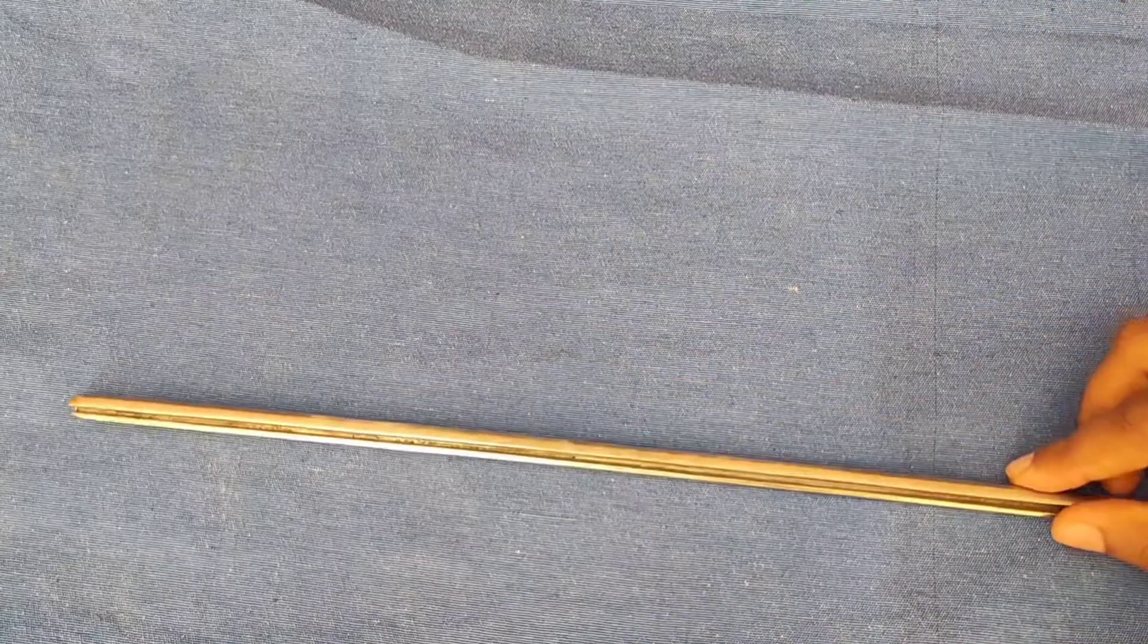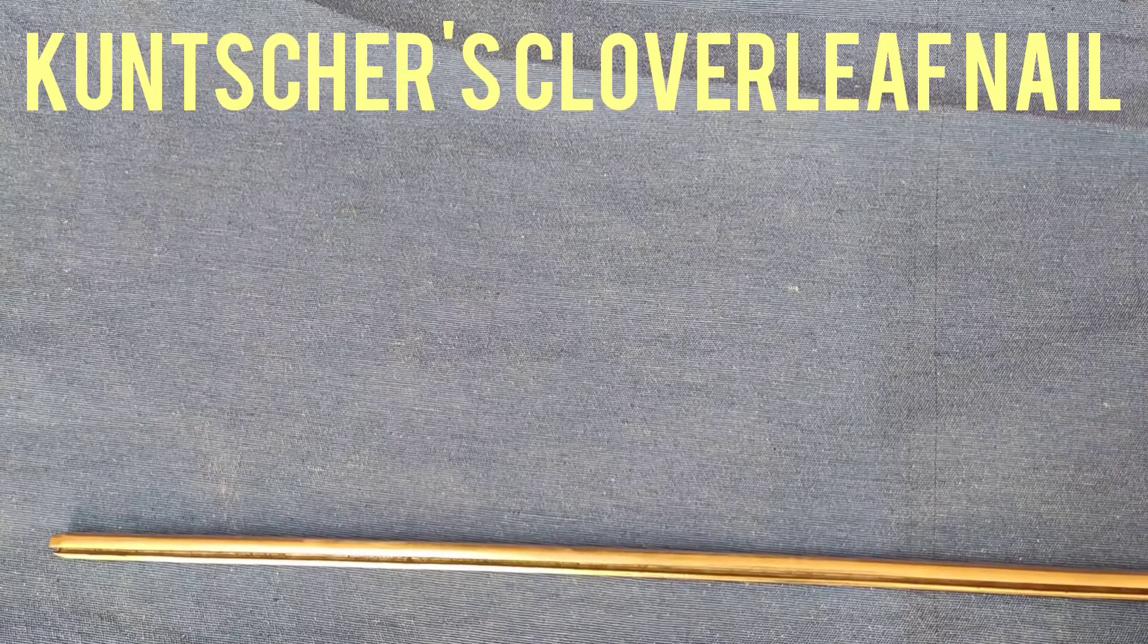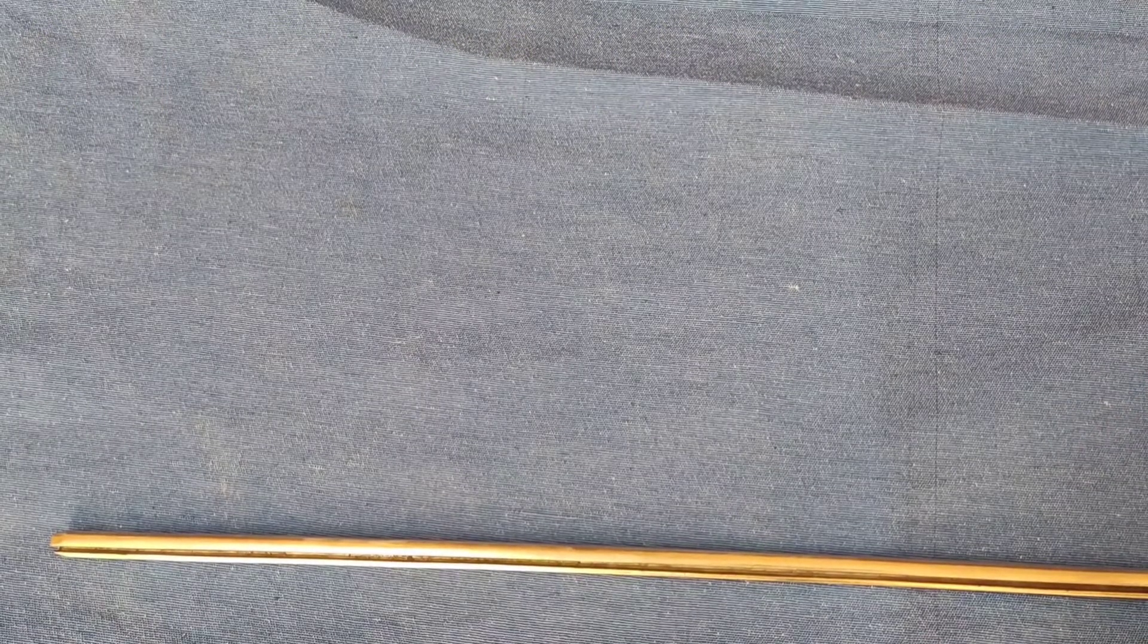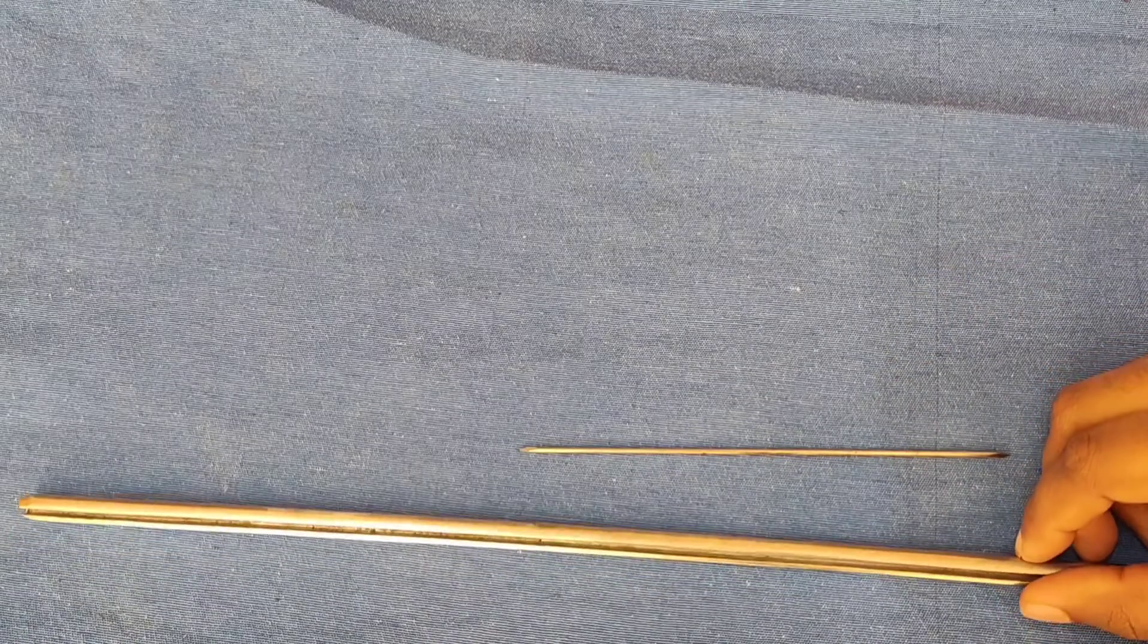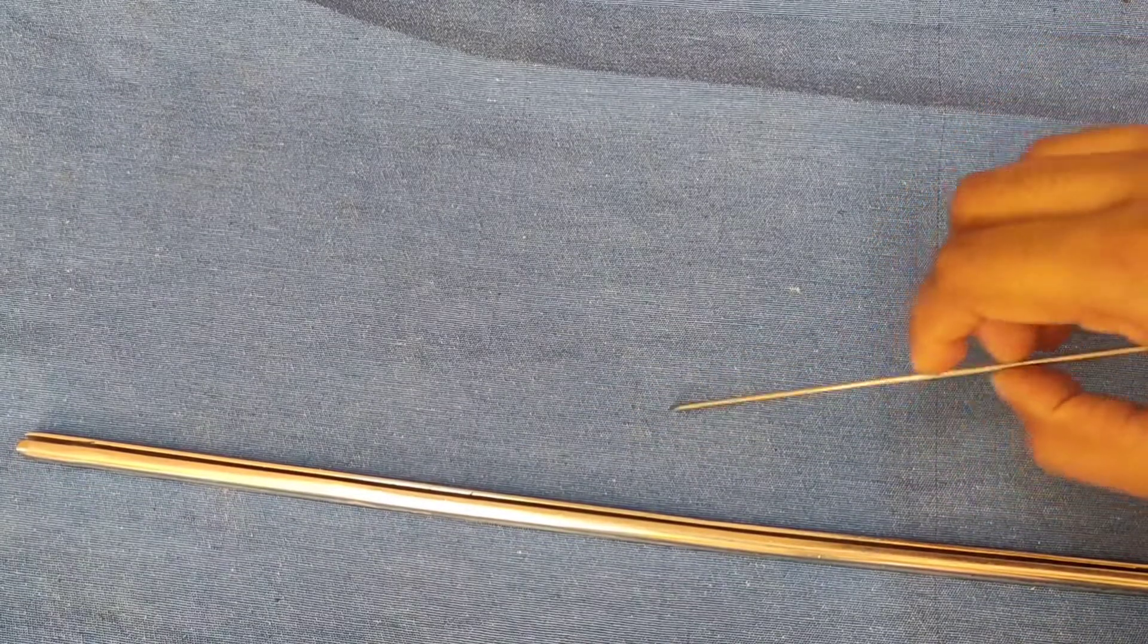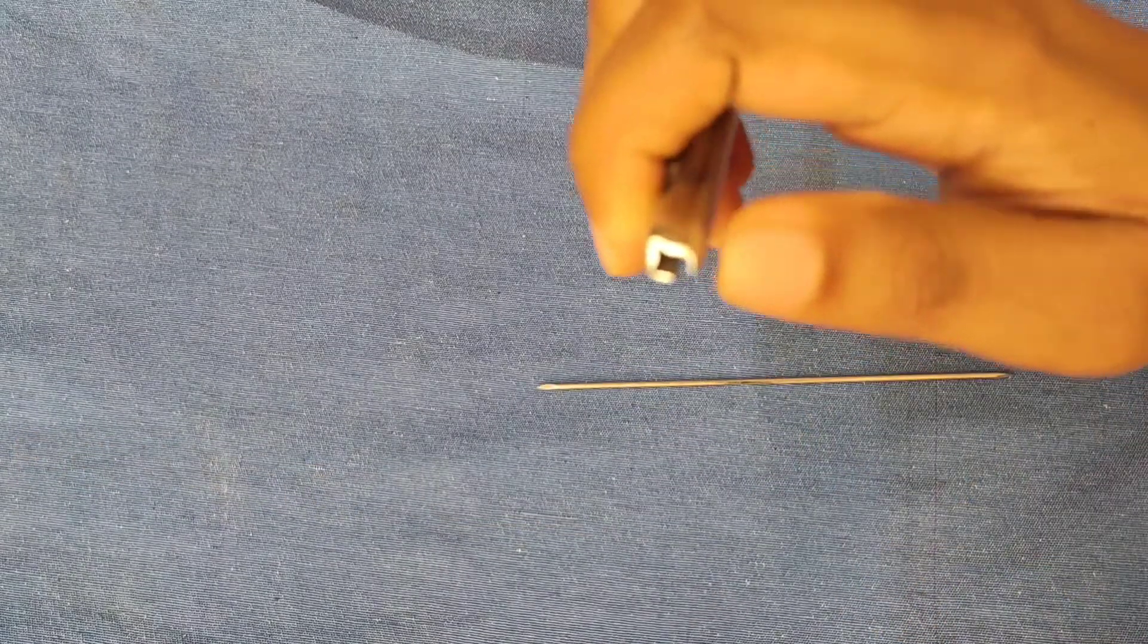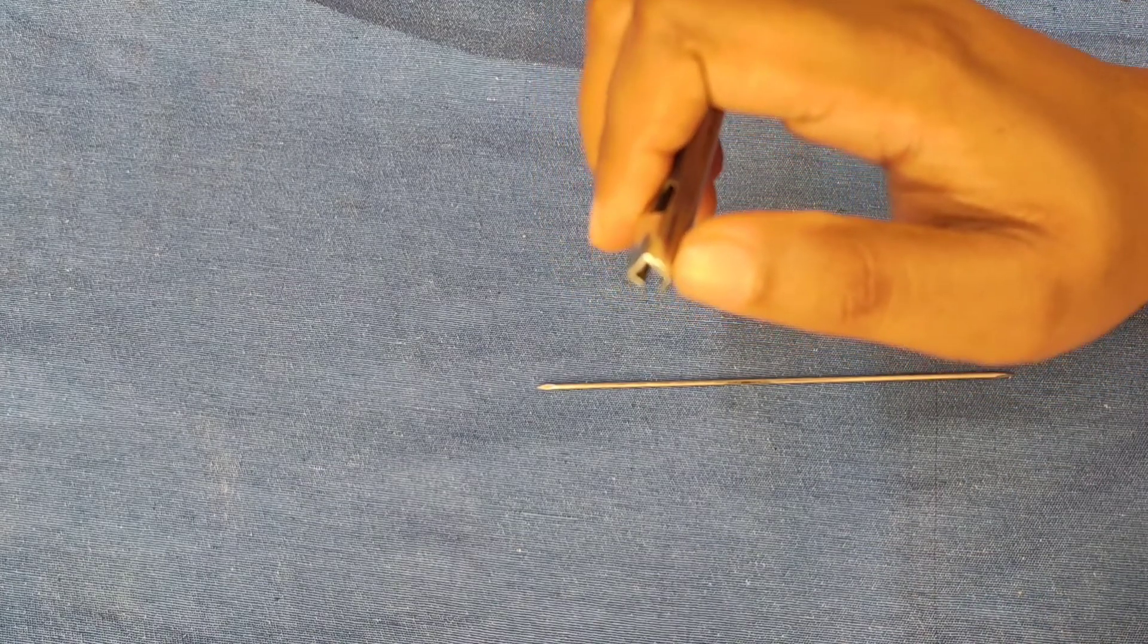Next is Küntscher cloverleaf nail. This nail is a centro-medullary nail which has two blunt ends with eyes. These blunt ends reduce chance of cortex penetration. It has a hollow shaft which allows bone marrow continuity and helps for guide wire to pass. It has a cloverleaf cross section.